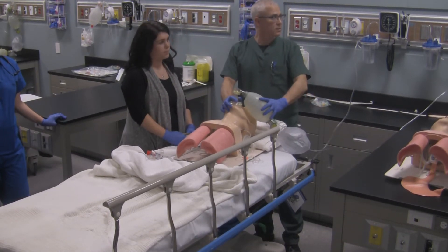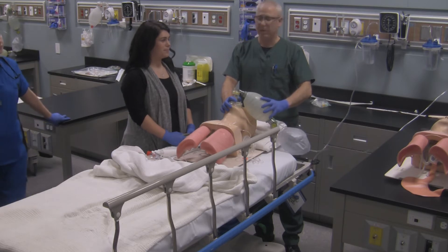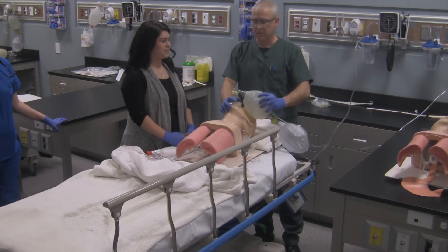How are his vital signs? 97. So he's still tachycardic, but we've got good ventilation going on here. Any dangerous arrhythmias? Nope.